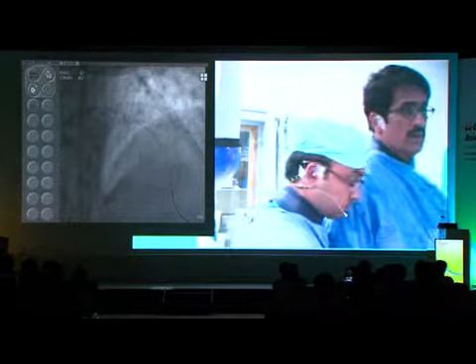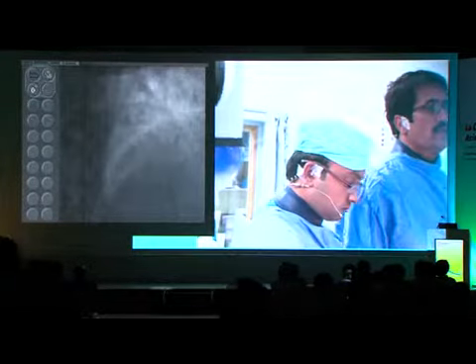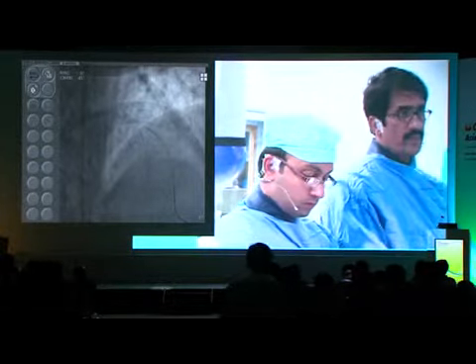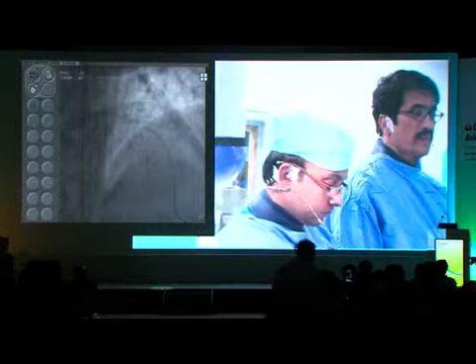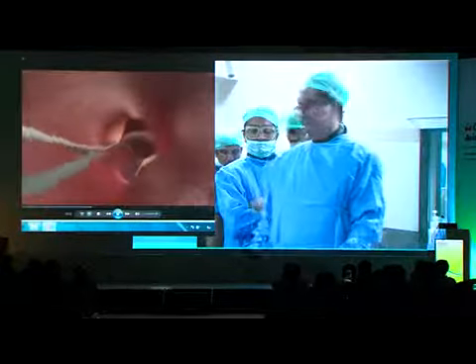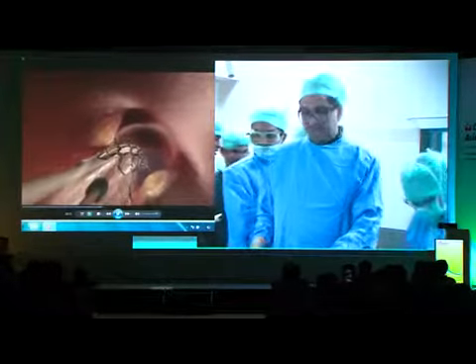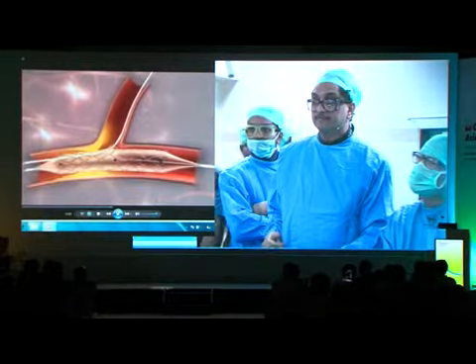Have you seen the animation or not? We are showing you the animation of the stent in the meantime. Ready?